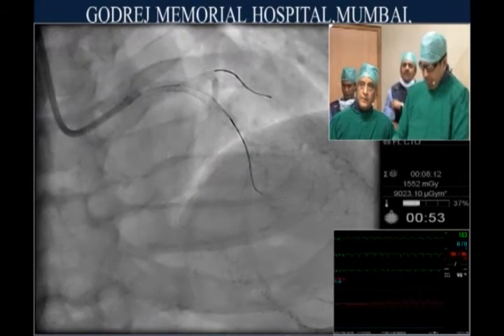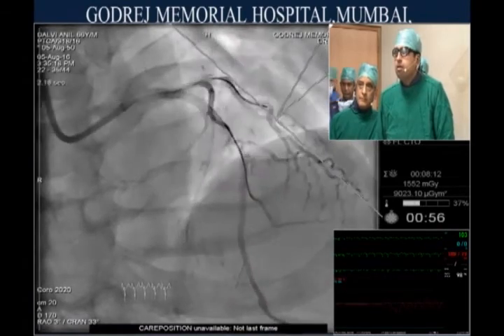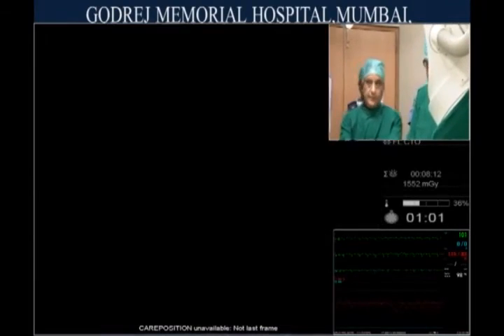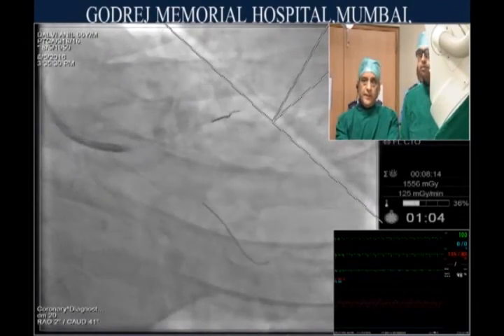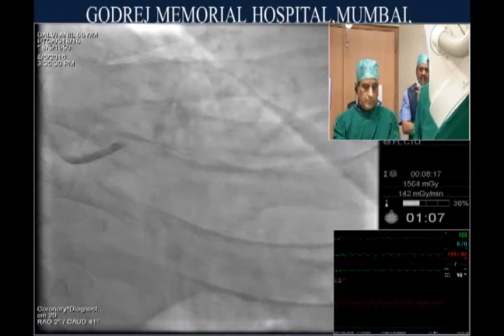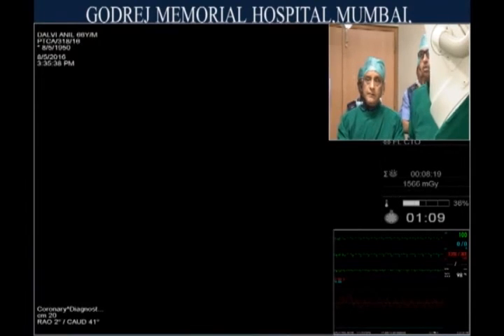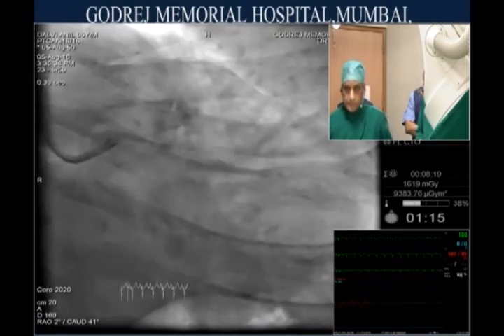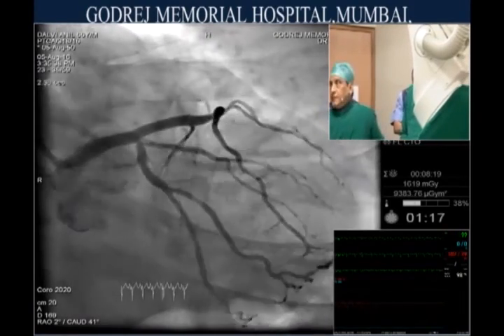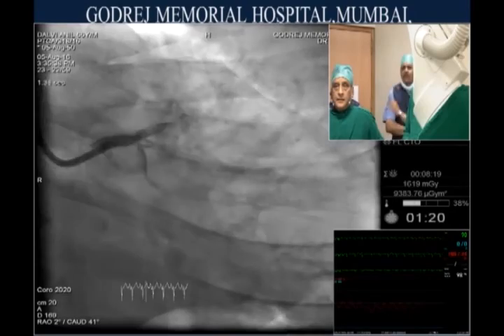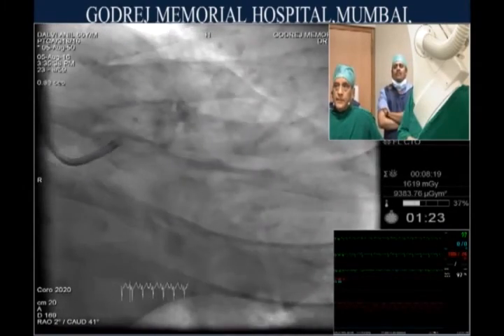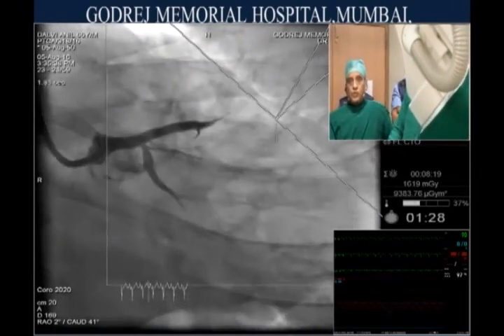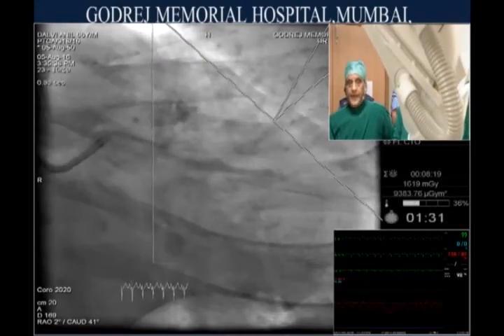Beautiful result. Go to the caudal view. We can take the wires out and take pictures — looks very good. That looks great, perfect. No EKG changes, patient doing very well. The question always comes in these cases: should you do a routine kissing balloon dilatation?